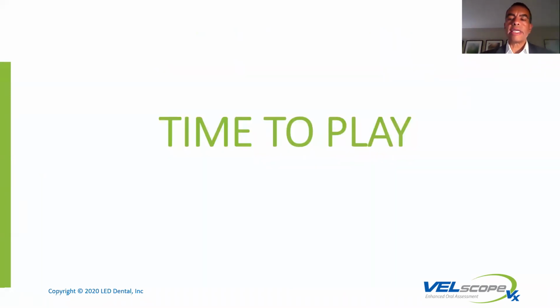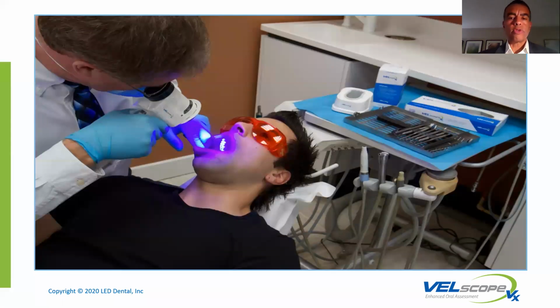So one of the things I want to make sure that you do is that we're utilizing the technology first in your own practice. As we end this, I want to make sure you use this on each other before you start using it on your patients. But understand that the learning curve is about you being comfortable with it. It's not about what you're seeing. It's just getting comfortable with your angles, your distance.